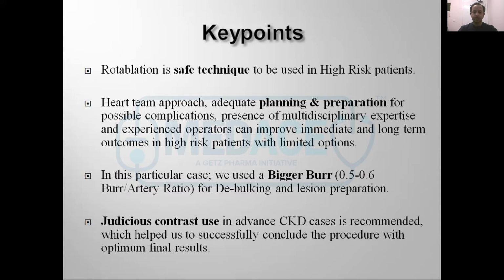In this particular case, we used a bigger burr with a 0.5 to 0.6 burr to artery ratio for debulking in lesion preparation. And most importantly, judicious contrast use in advanced CKD cases is recommended to prevent post-procedure contrast-induced nephropathy.